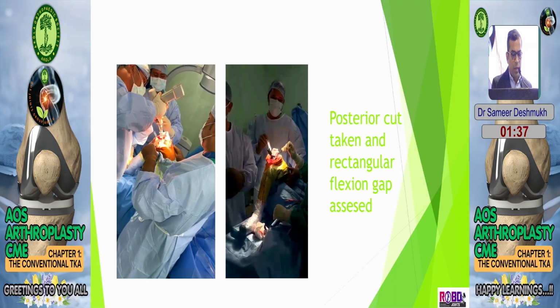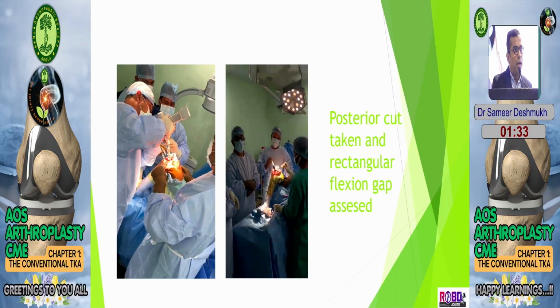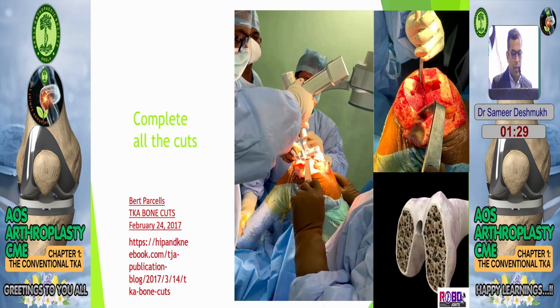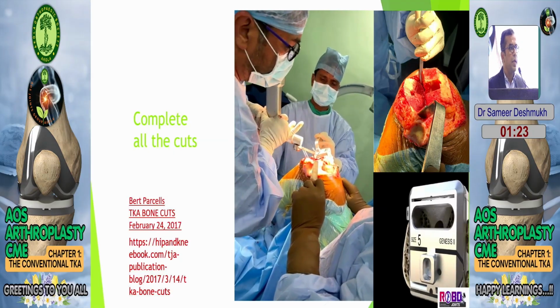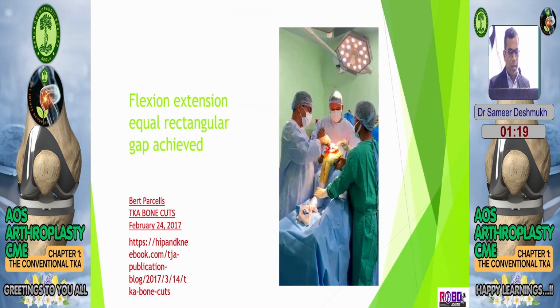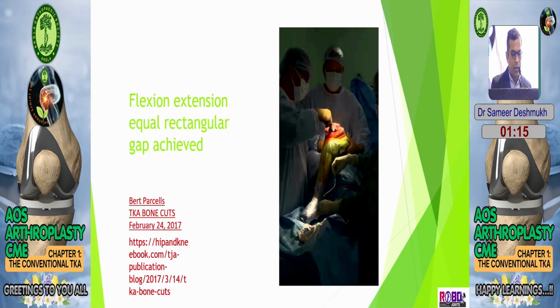Then I take a posterior cut, and after doing the cut, I again put a block and see whether I have balanced the gap in flexion at 90 degrees. Then nothing is left, the surgery is done. All the femur cuts, the chamfer cuts, anterior, posterior, all are done. Then flexion and extension gaps are rechecked after the cuts.